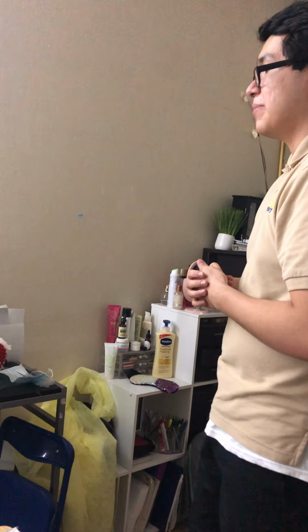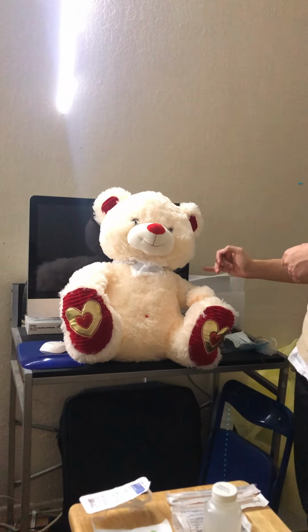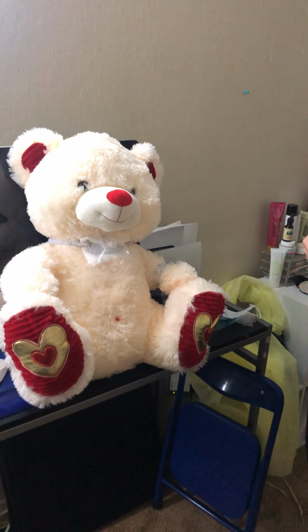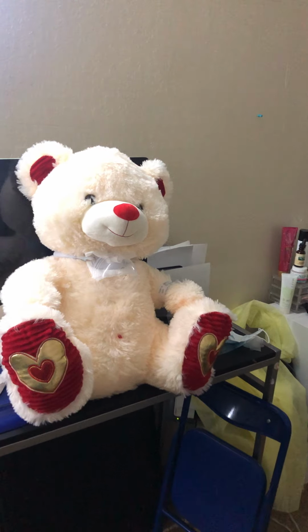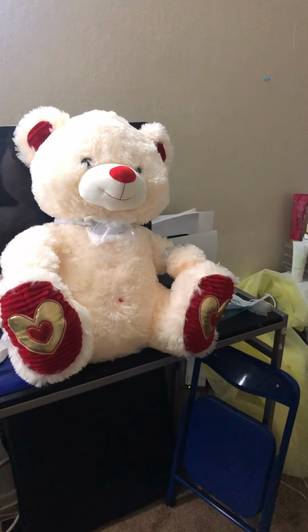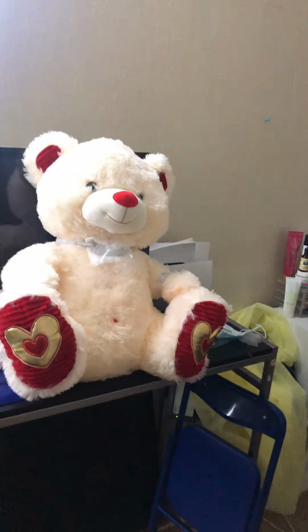I'm going to go ahead and ask for your name and date of birth. Double check with his armband, make sure everything's correct. Name, date of birth, it's correct. He tells me his name is Jerry Brown, birthday 11/11. Okay, Mr. Brown, do you have any allergies? He has no known allergies. And I'm just going to be performing tracheostomy care.